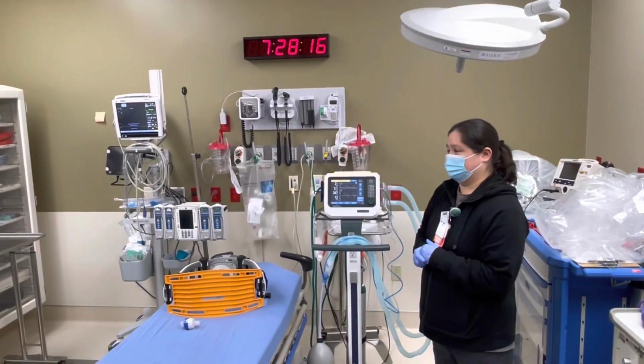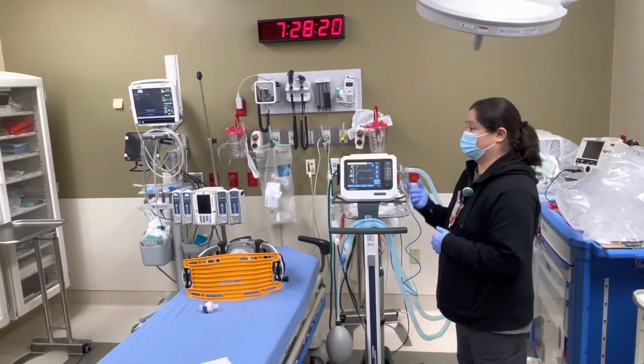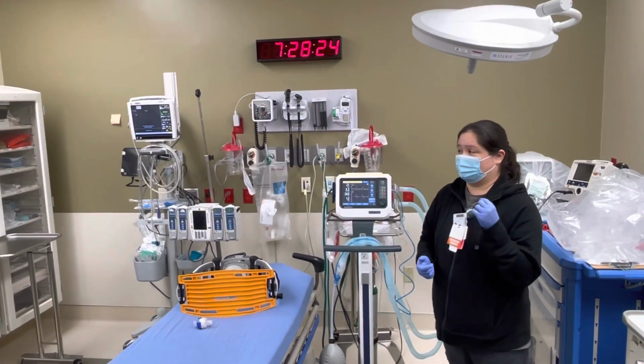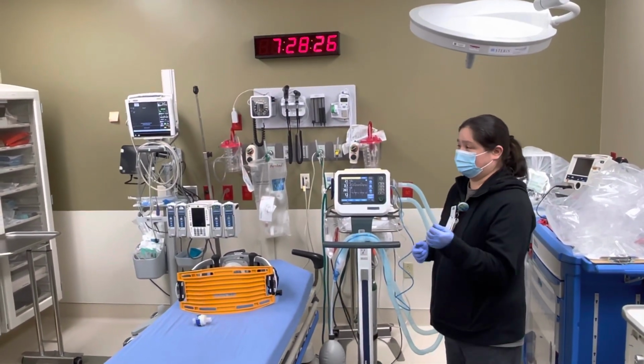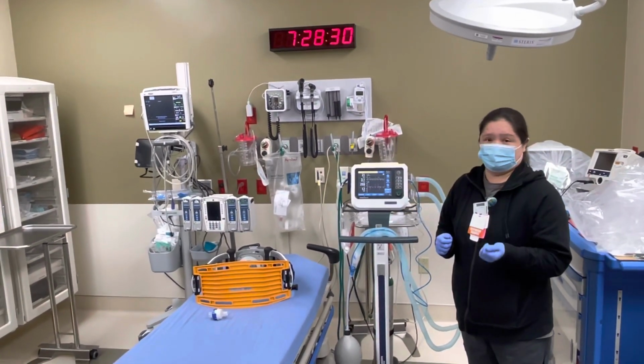And then according to the gas, if the CO2 is high, you're either going to increase your respiratory rate or your tidal volume. Gotcha, that makes sense. So for ventilation, it'll be respiratory rate and tidal volume. For oxygenation, it's going to be your PEEP and FiO2.